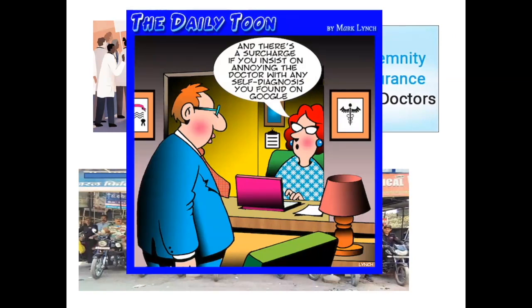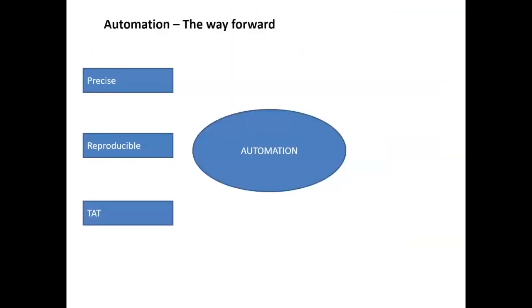So the point that I want to make is, nowadays the patient and the relatives are so aware, they come back to you and ask whether my report is correct or not. We did it in the other lab, it was something else. So you need evidence for what you have reported, and that is what the theme would be: to have visual evidence, to keep it as evidence for getting confidence while reporting.